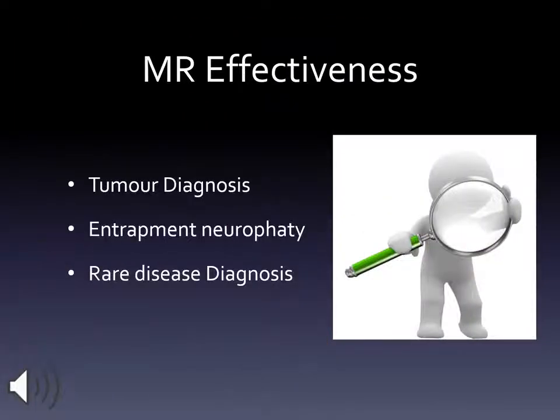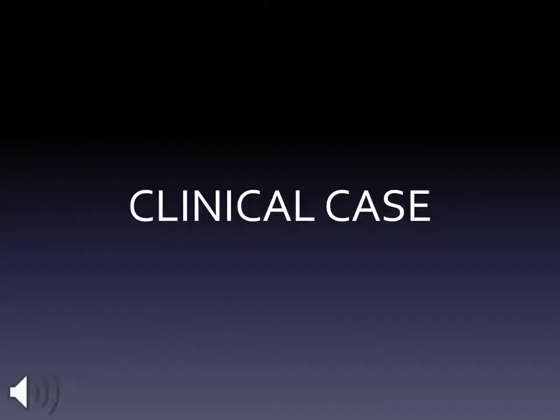The effective use of the MR is well established in the diagnosis of tumors and entrapment neuropathies, but it also proves itself useful in the event of difficult-to-diagnose and infrequent pathologies. Let us see an example.